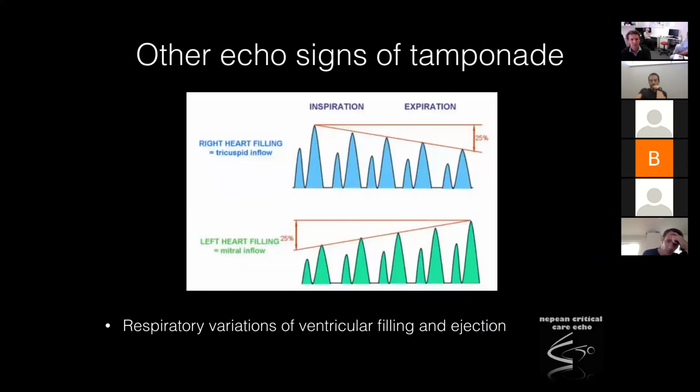So yeah, just the bottom line is it's really important to check the IVC to make sure it's dilated. Okay, from the advanced side of things, using Doppler, so making sure the angle of interrogation is appropriate, making sure your scale is right, and making sure that your sweep speed is right. So you're assessing at least, say, 6 or 7 cardiac cycles because you want to see the respiratory cycle.